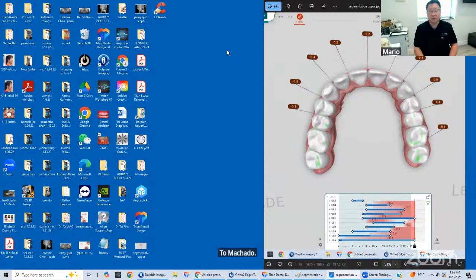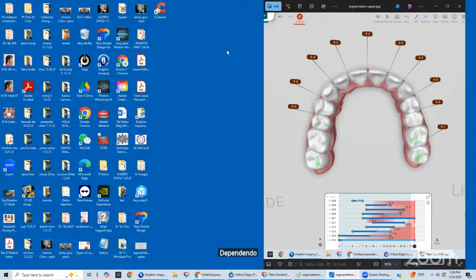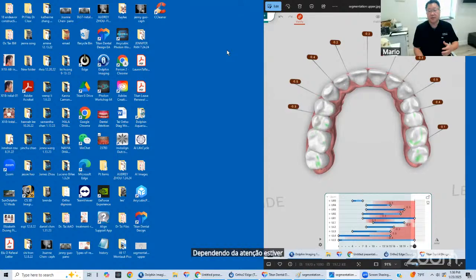But yeah, absolutely. Right now what I do is I give out 6 to 8 aligners, and depending on the patient, I tell them 10 to 14 days is my typical. It's a lot longer than what everybody else is preaching, right? They're saying 7 days, everything. But it also depends on how you program the movements, right? You slow down the movements, perhaps you can do 7 days, because every movement is so tiny. And then you get a fresh one every week, so you feel like there's progress. There's a lot of psychology involved as well.